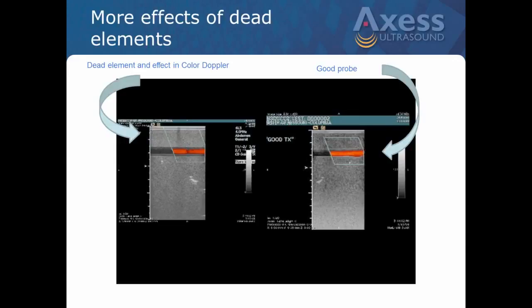That typically leads me to look at the wiring to that element, as to whether that's making good contact. You can really get crazy and go down and look into the system side and see if you've got a channel out in the system where you're not, again, providing the transmit, receive pulse properly to the probe. So that is a great question, but that's typically where the weak element is, once an element's going to work or not and go bad or stay good.